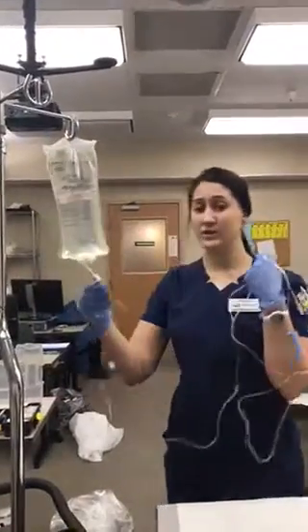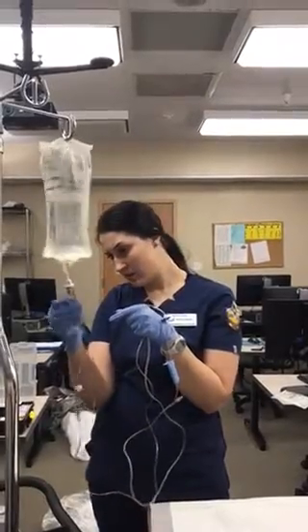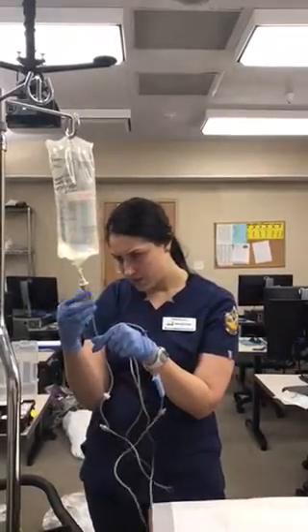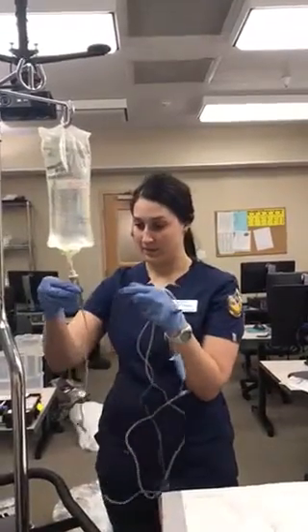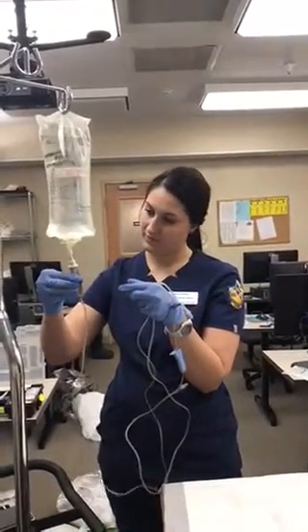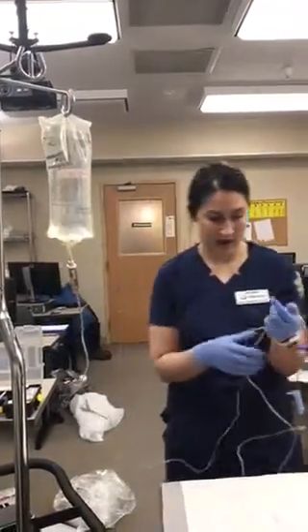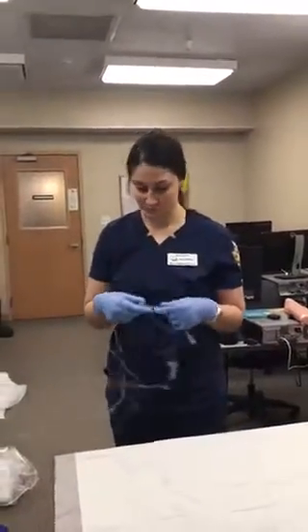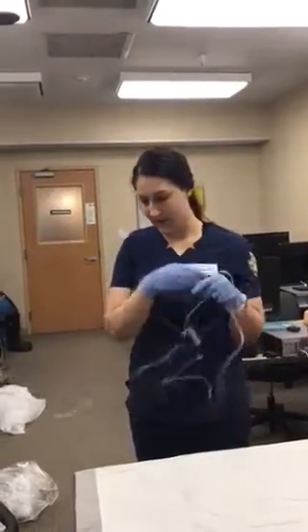So the next thing you want to do is fill your drip chamber. This one does have a little bit of a line there, but you want to make sure it's just about halfway. Okay, so now that that is halfway, I'm going to go ahead and prime my tubing. You want to do this just so that you don't get any air bubbles or anything like that into your patient.